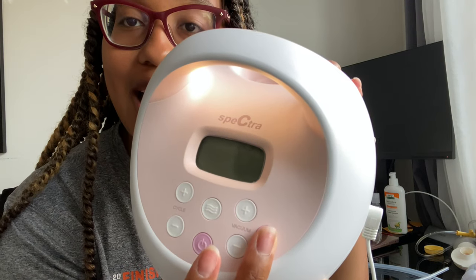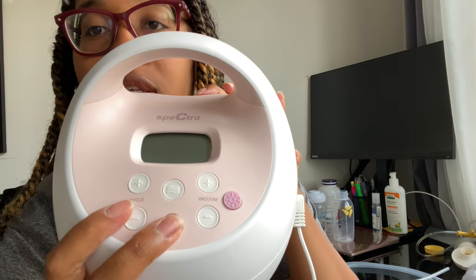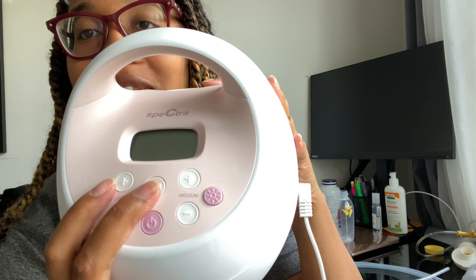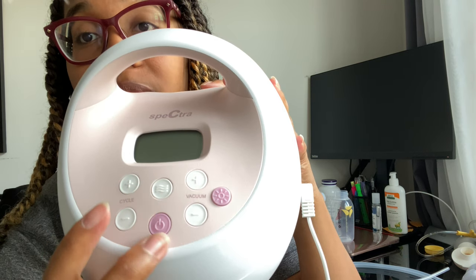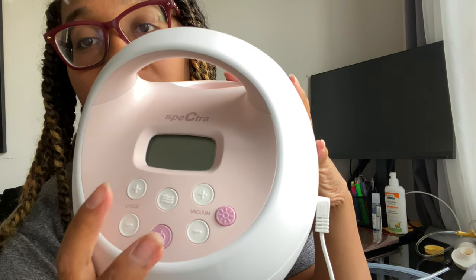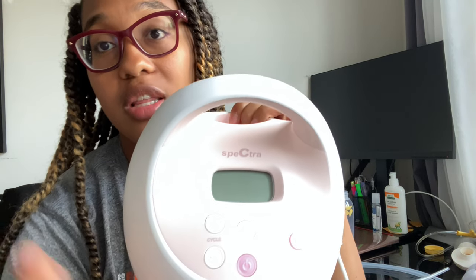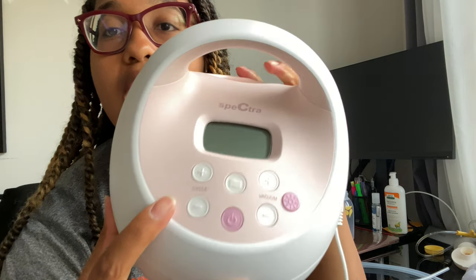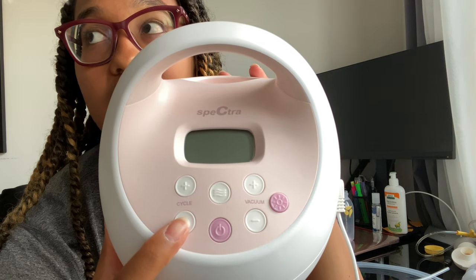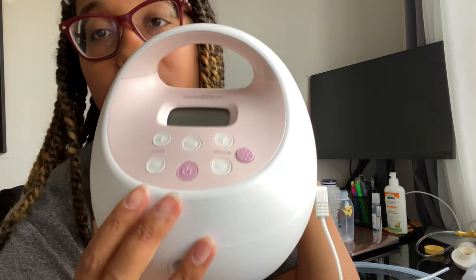So this has a light - you can see it turns on there, and you can make it even brighter. This is key for moms who do middle-of-the-night pumping or early morning pumping. Now let's power this on and go through all the settings. This is your power button. This is your letdown and expression button - alternating between letdown and expression. And then this is your cycle button. And this is your suction - on here it's called your vacuum - so stronger or lower suction, very similar to the plus and minus on the Pump in Style.